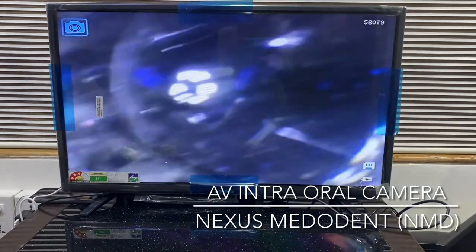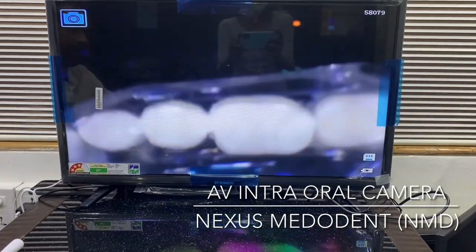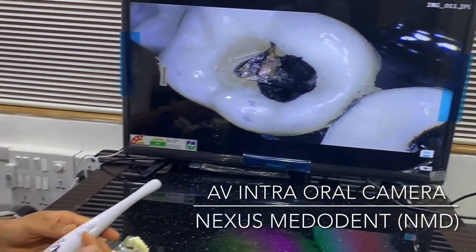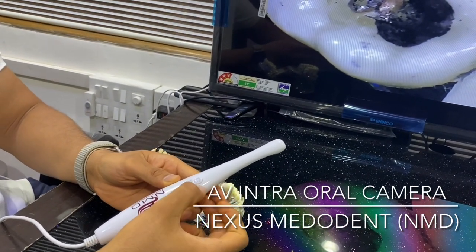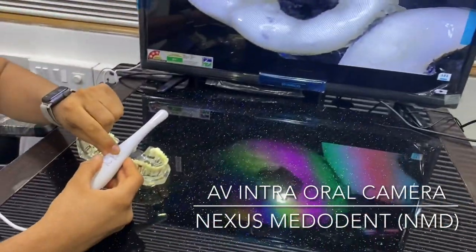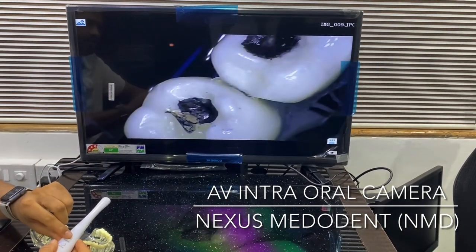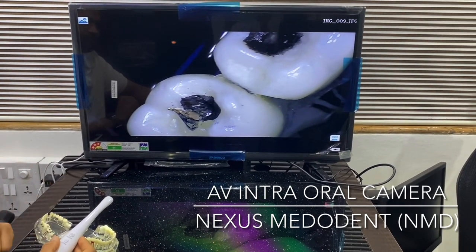Now if we want to see the pictures again, all we have to hit is the picture button. Here are the pictures we clicked. These two buttons can be used to scroll up and down. This is picture number 11 — if I want to go to picture number 10, I can go directly from here. This was a hazy shot — I think my hand shook — but this was a nice shot. You can directly browse all the pictures from here.